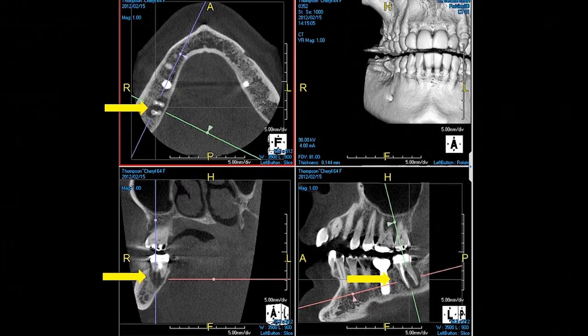Look at this. This is the same tooth. So this doesn't look that impressive. Boy, that does. And so then you go back and look at the X-ray. You said, well, yeah, there is something going on there, but this kind of confirms that this tooth's got to go.